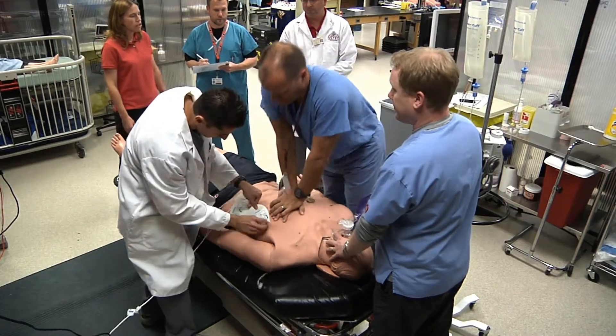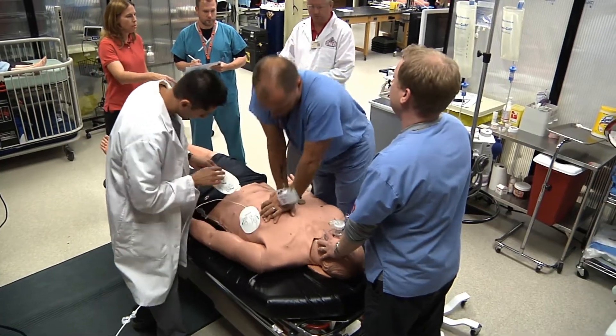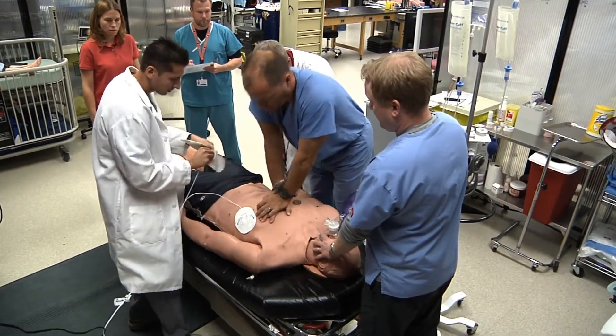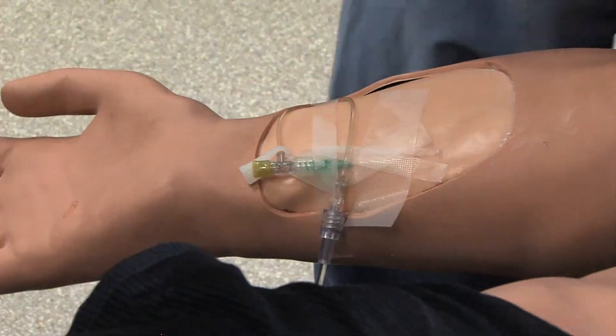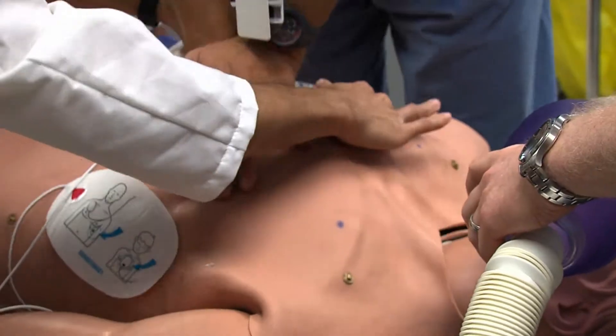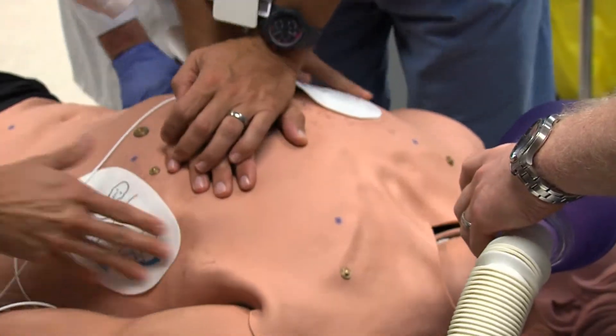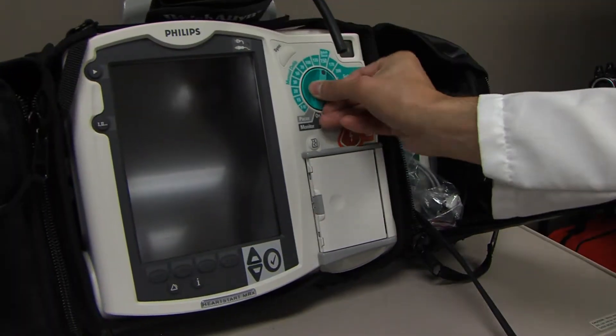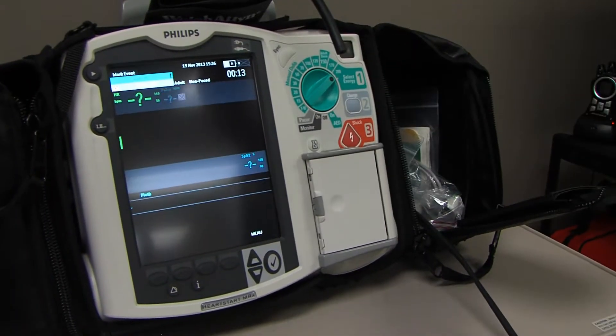IV med person, can you place an IV and be prepared to give medications? Sure. We have an 18-gauge IV in the right forearm, normal saline running wide open, and we're ready to administer medicine.